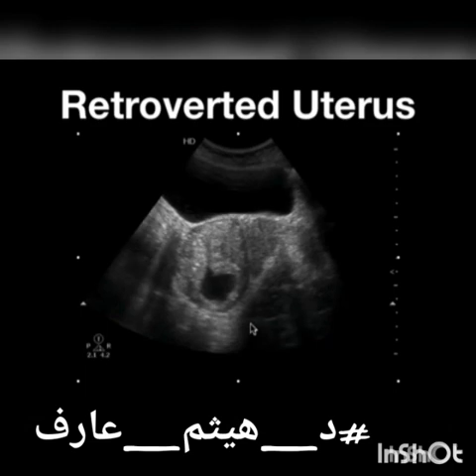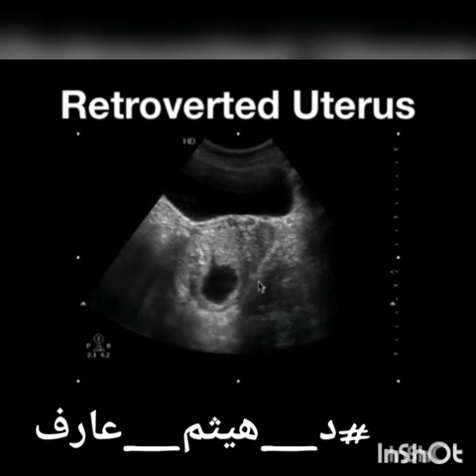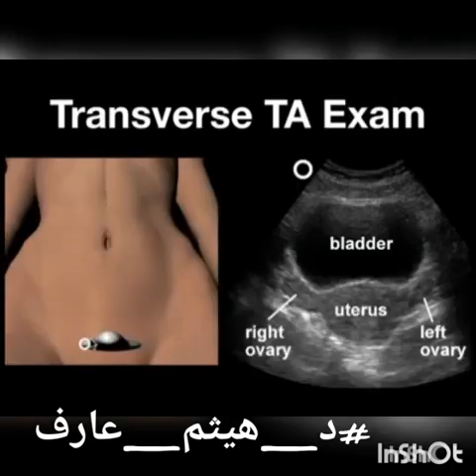So this is a retroverted uterus, and the cul-de-sac is back in here. On the transverse exam, you're going to take the transducer and place the indicator towards the patient's right. Again, you're going to be just cephalad to the pubic symphysis. This is going to provide you the following image: anterior, posterior, patient's right, patient's left. Here's urinary bladder. Here's a short axis view of the uterus, and cul-de-sac will be back here.